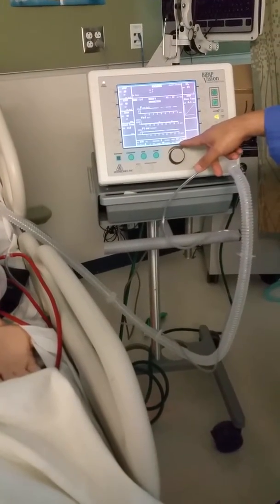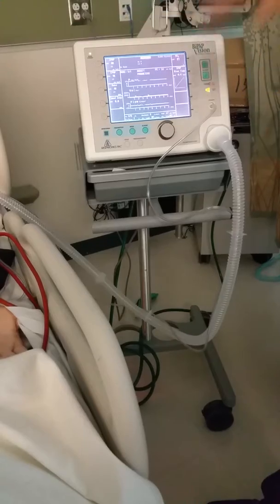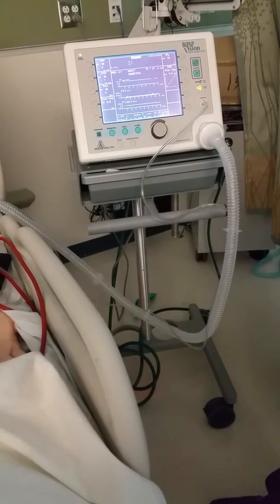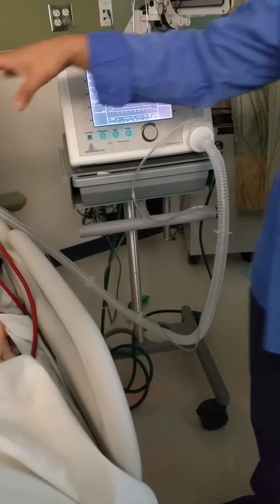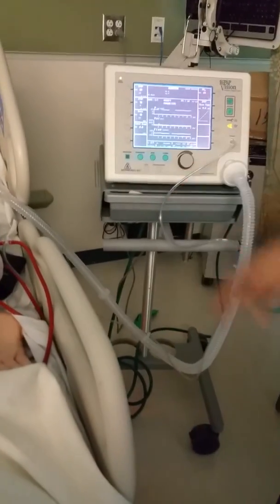Patient trigger just means how much of the actual breaths the patient is triggering. We're getting a little bit of auto trigger with this because of the flow. It's actually bouncing back and the machine is sensing it as a breath. That's why it's kind of titrating like that. His lungs aren't that compliant. I think that's why it's bouncing back at us. Last year when I had the V60 hooked up to him, we had great chest rise and it was working just fine. So I don't know if it's just because he's not turned on.